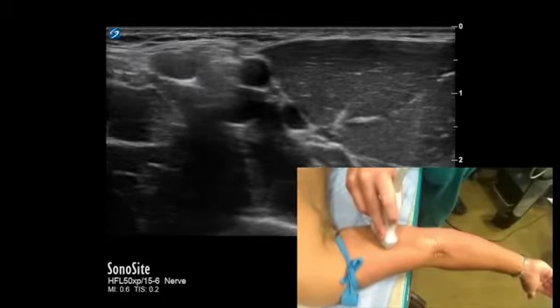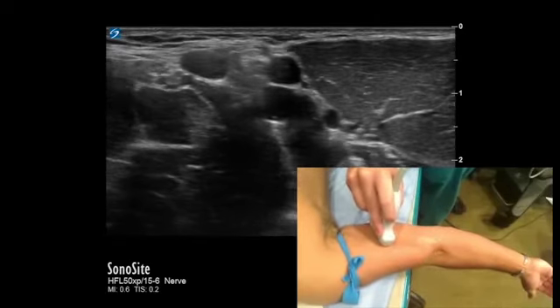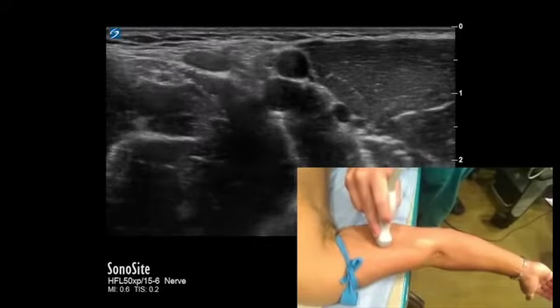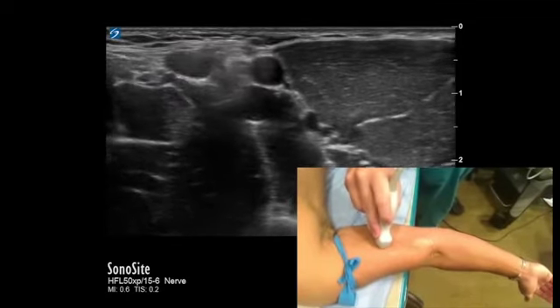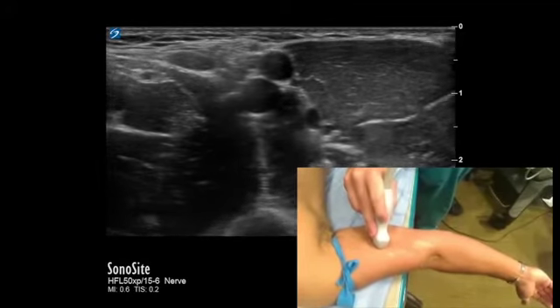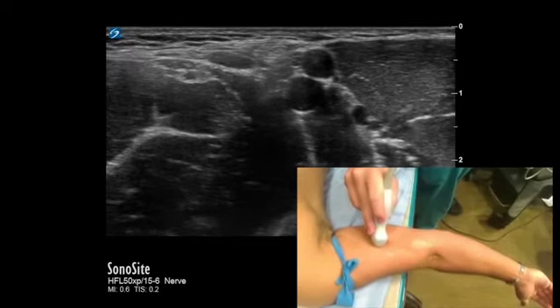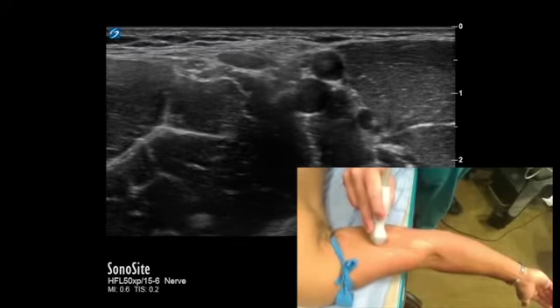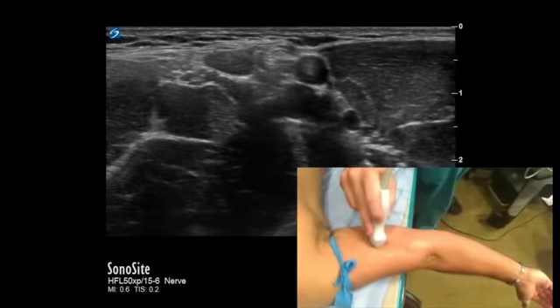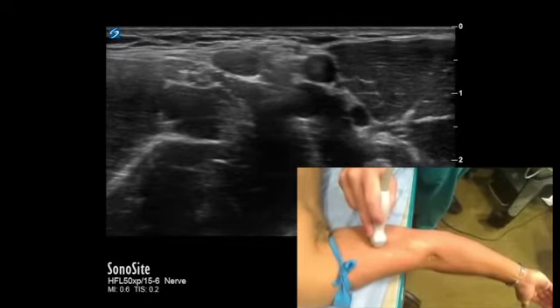So we see the brachial veins associated with the brachial artery, again, just below the brachial artery in this ultrasound image. And to the left of that, we see the basilic vein. And we can see that we're actually applying some compression to it. So adjusting by sliding our probe more medially or down to the patient's bed, we'll put that in the middle of the screen, and we can see the basilic vein now sitting in the middle of the screen there. You can see that it's the largest diameter vein and the most frequent access site for PICC lines.